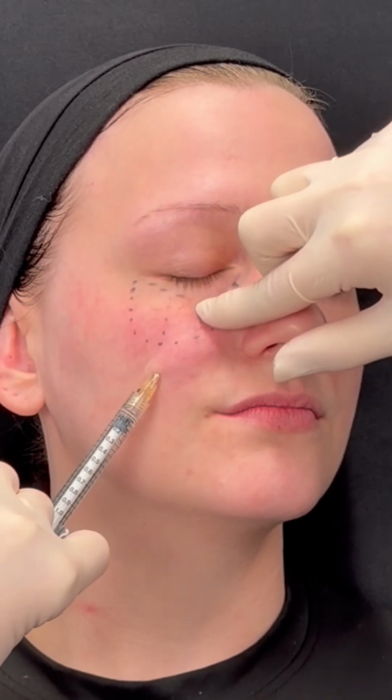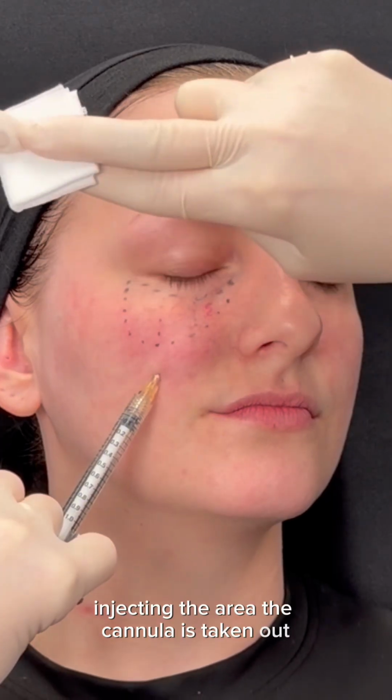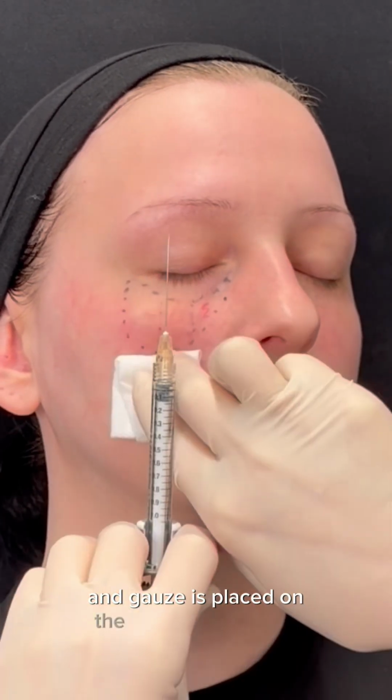Lastly, when I'm done injecting the area, the cannula is taken out and gauze is placed on the orifice to stop any bleeding.